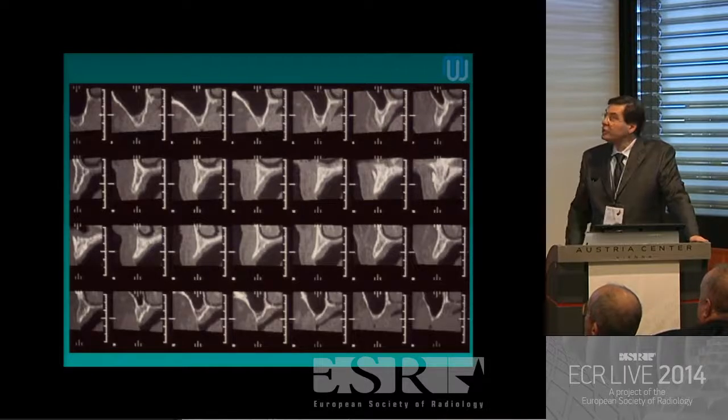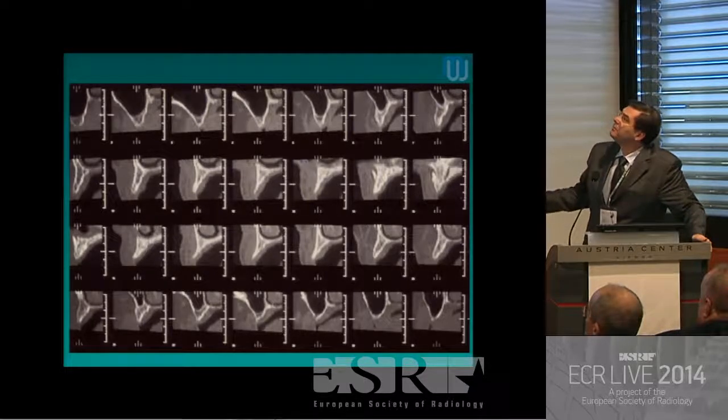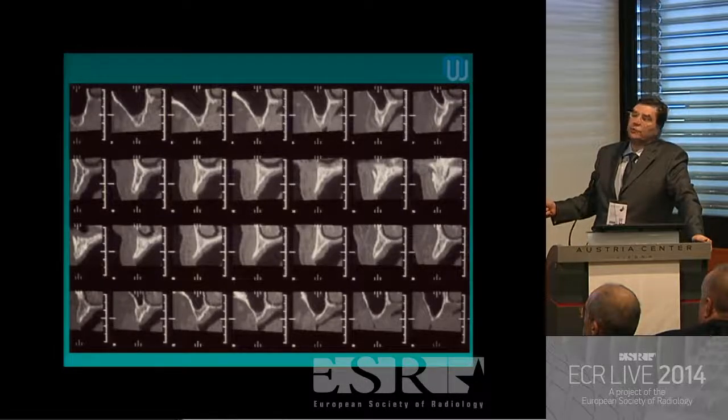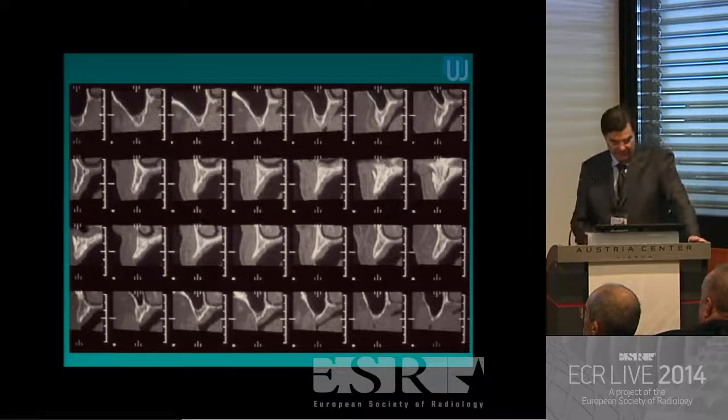This would be an upper jaw. Same from the right upper jaw with the maxillary sinus. The midline would be about here. This is the incisive canal, and this would be the left jaw here. And there you see a strong atrophy on the side, and you see a knife edge ridge here. So you can only cut away a little bit from this knife edge ridge and take a shorter implant. That would be something like a solution when you have such a knife edge ridge.